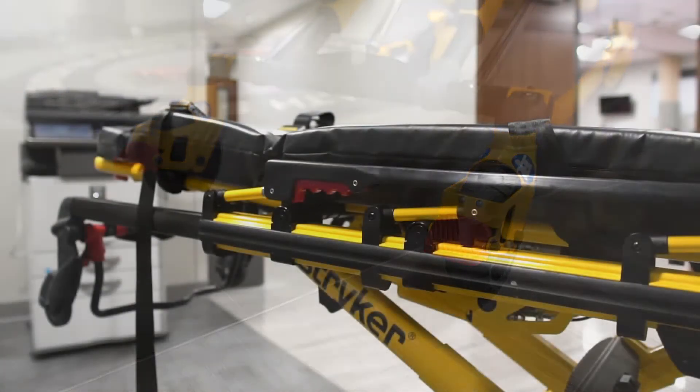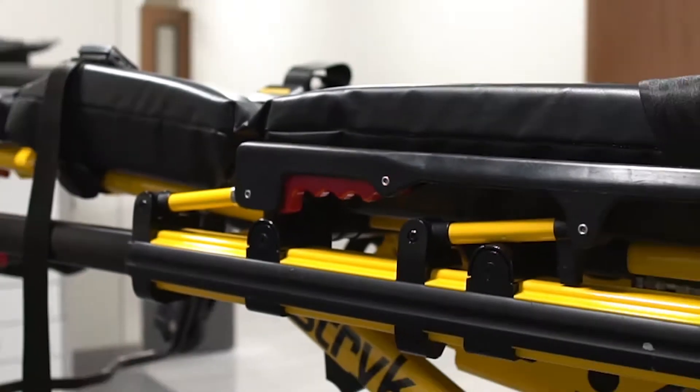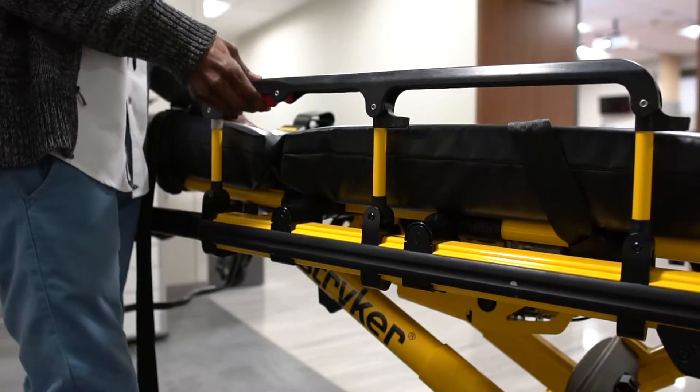This is the side rail of the Stryker. To access it, just grab and squeeze the red handle and lift. And to bring it down, just reverse the raising process.